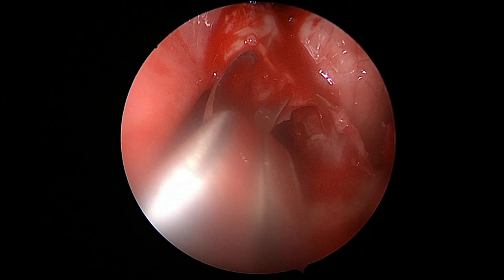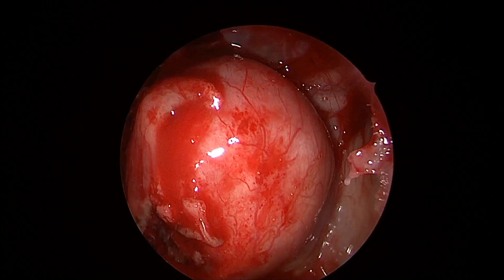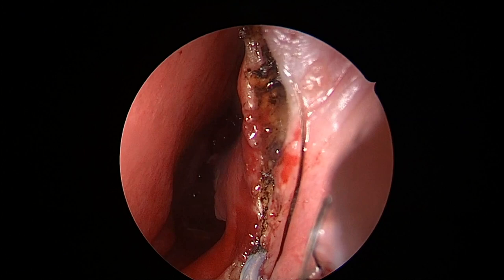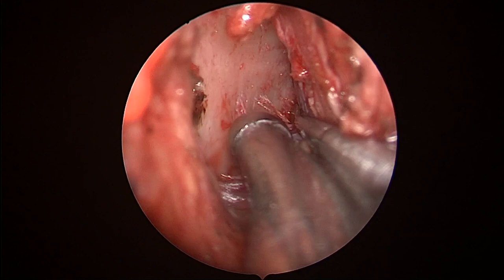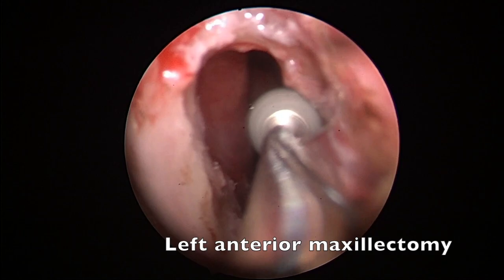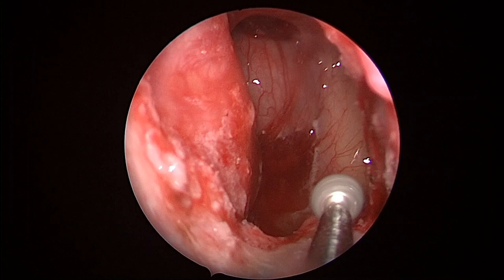The mucosa was elevated and we were able to get control of the sphenopalatine vessels coming out of the sphenopalatine fossa. Visualization of the tumor bulging at the posterior aspect of the maxilla was complete. We decided to perform an anterior maxillectomy with an incision of the mucosa medial to the piriform aperture. The mucosa was reflected medially, the bone of the piriform area was exposed, and the anterior wall of the maxilla was drilled through the left nostril, allowing access to the anterior aspect of the maxillary sinus.